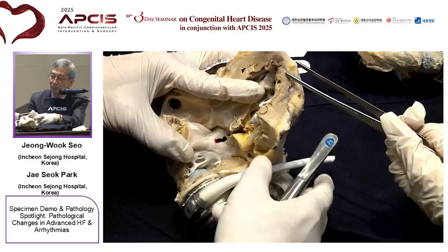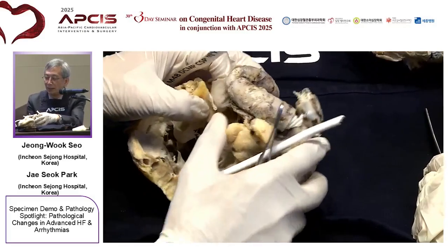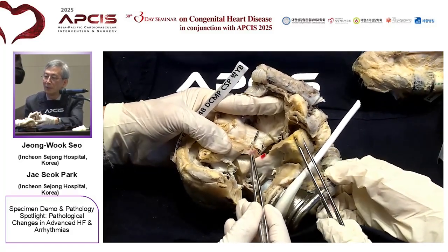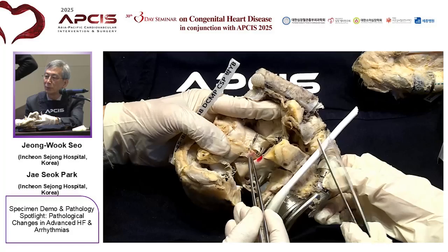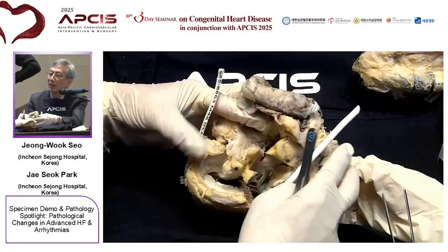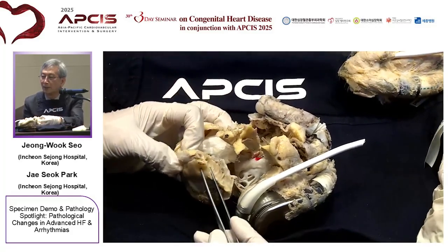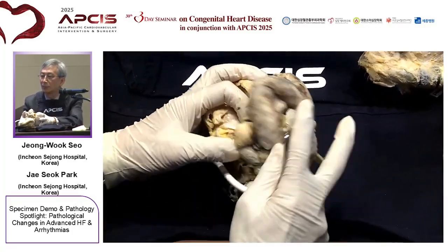So we don't know if the patient would have more penetration of the CSP lead, but because of the fibrosis, it has to be very hard to produce a good QRS complex by the CSP lead. And also in this patient, he said he tried CRT lead placement but failed. But I'll show how a CRT lead is applied.